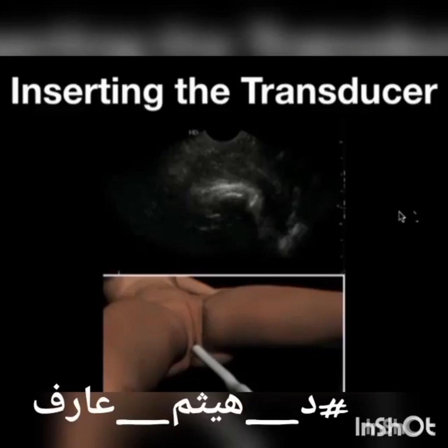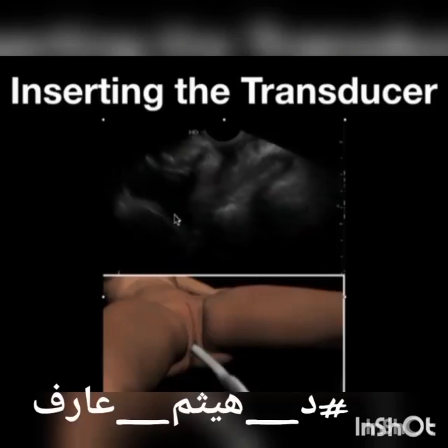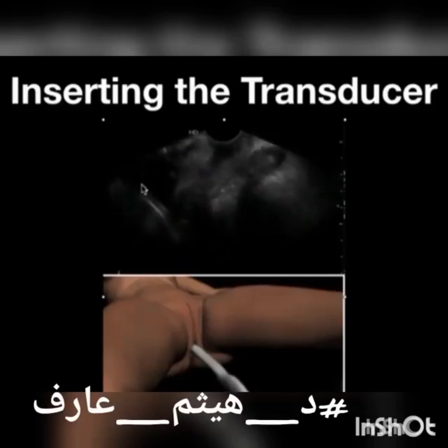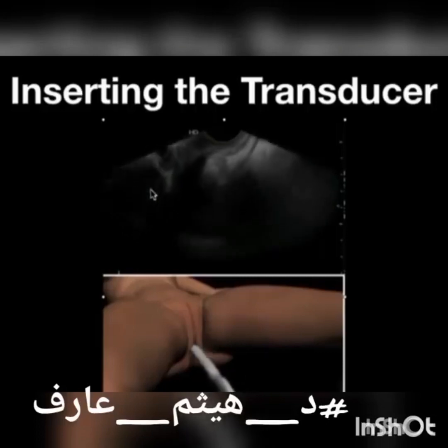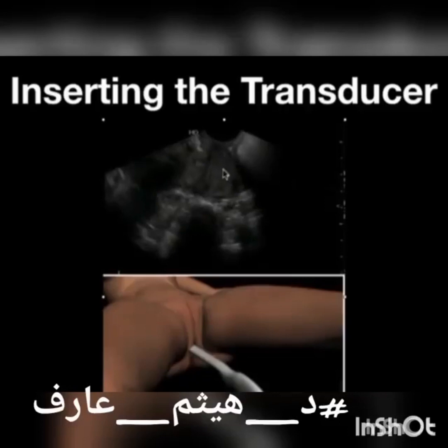When you insert the transducer, you want to make sure you start watching the screen the minute you insert the transducer, and you're going to start looking for landmarks. The first thing that you may see when you go in is going to be the urinary bladder. You're going to next attempt to find the cervix in the lower uterine segment, which you're seeing right here. You would then need to adjust your depth as needed. You can see here is cervix and lower uterine segment.